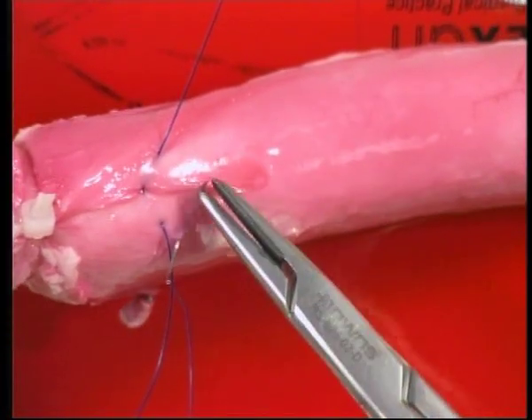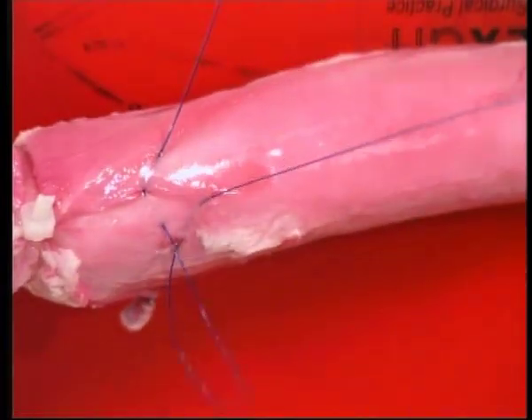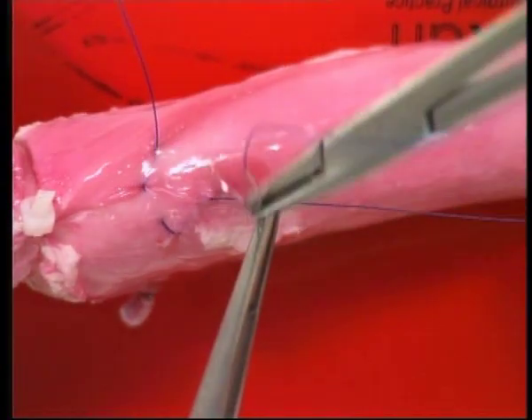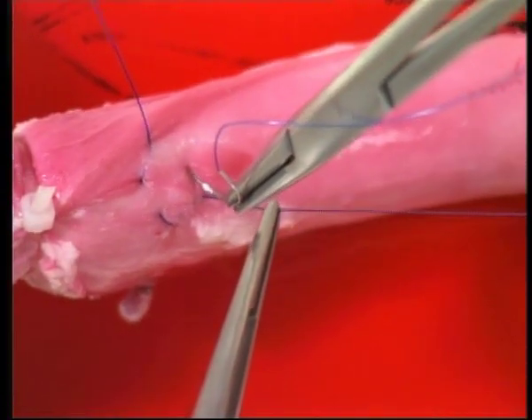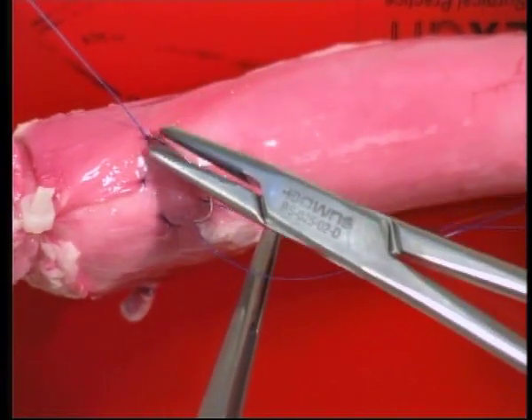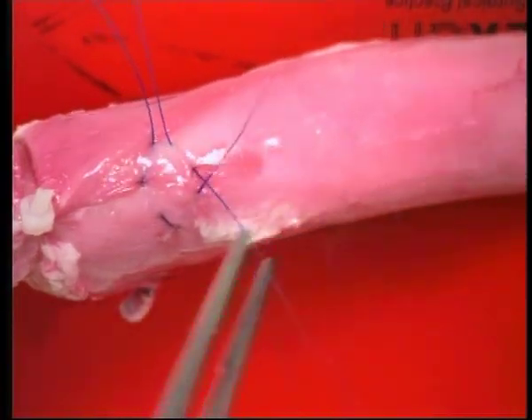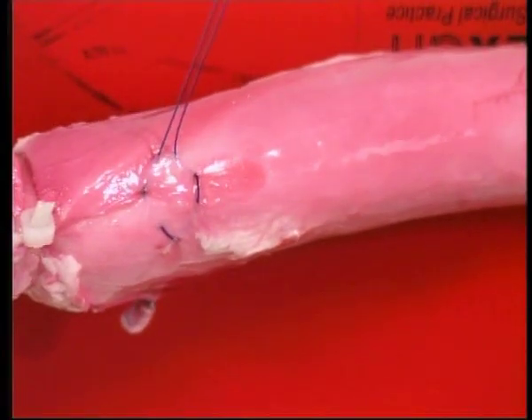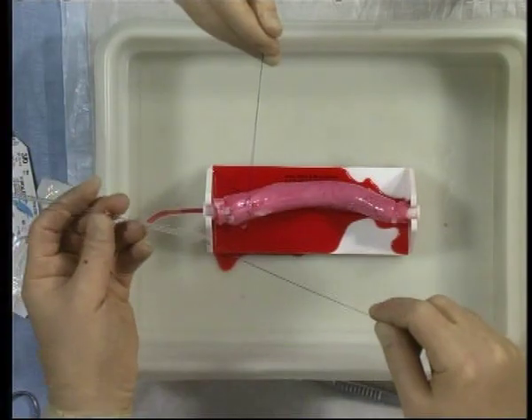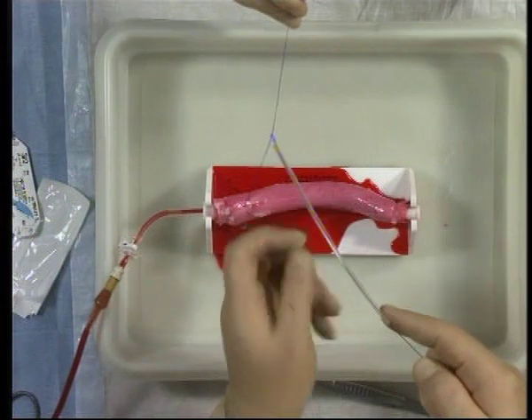Full thickness penetration of the aortic wall will cause troublesome bleeding. The two arms of the suture are brought together, the needles cut off and the suture held in a snugger.